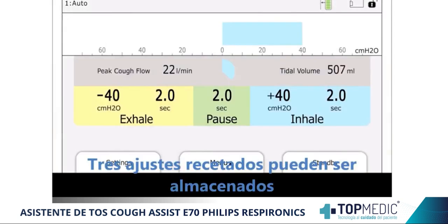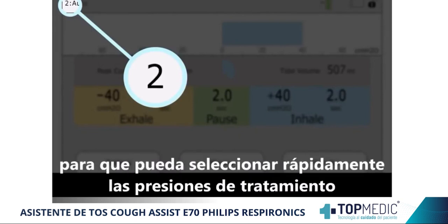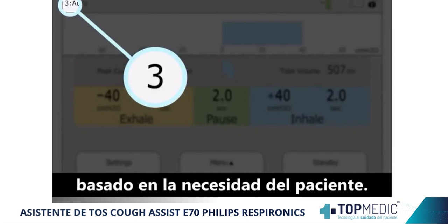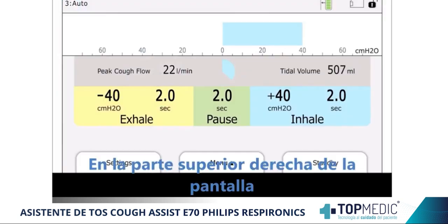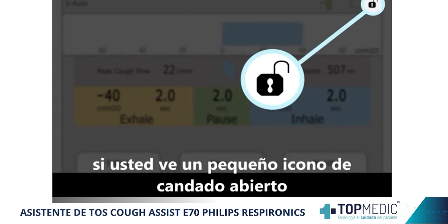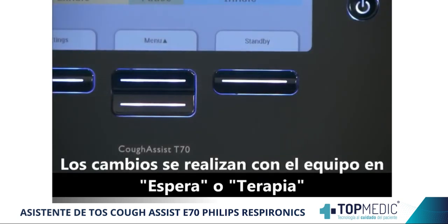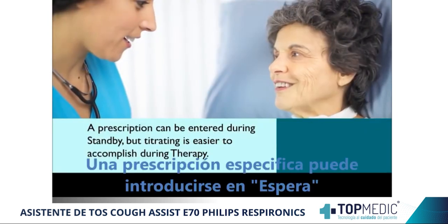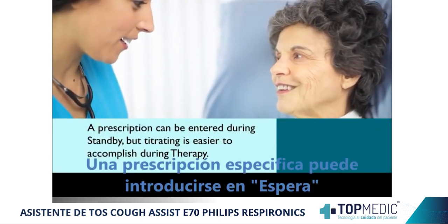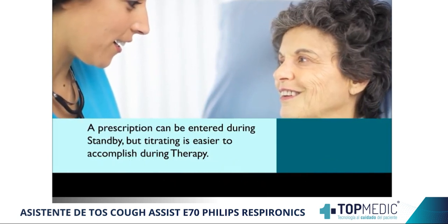3 unique prescription settings can be stored in Cough Assist T70, so you can quickly select treatment pressures based on a patient's current needs. On the upper right-hand side of the screen, if you see a small open lock icon, you will be able to make changes to the settings. Changes can be made to the settings during standby or therapy. A specific prescription can be entered during standby, but titrating is easier to accomplish during therapy.